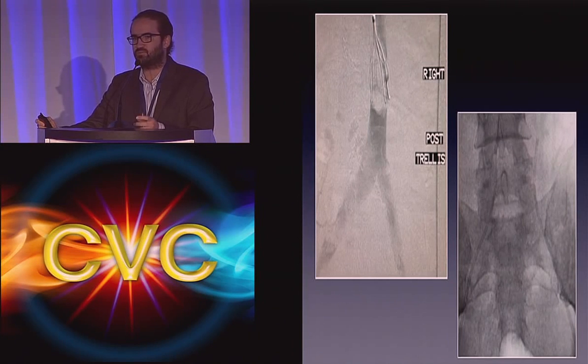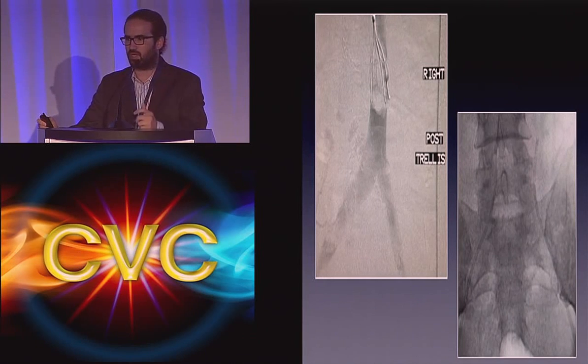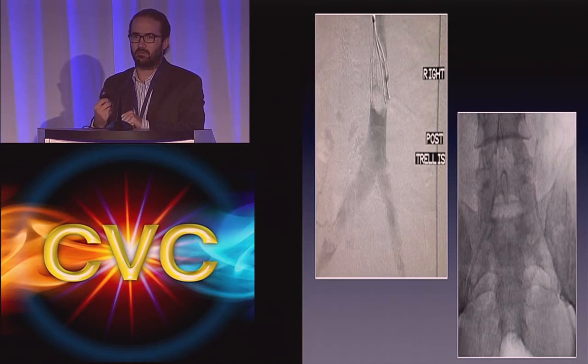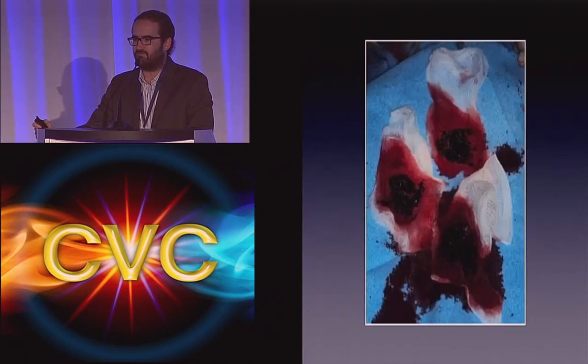And unfortunately the aspiration ports of this device are pretty miserable, so the step of aspiration that this device provides, with apologies to the company, is really useless. So we don't even do that step. As you see, what we do is we put in 8 French guiding sheaths, and we just manually suck by moving, in a cautious way, not forcefully, up and down, to not create a whole lot of endothelial damage. But we do get a very impressive amount of clot that comes after the pharmacomechanical lysing.